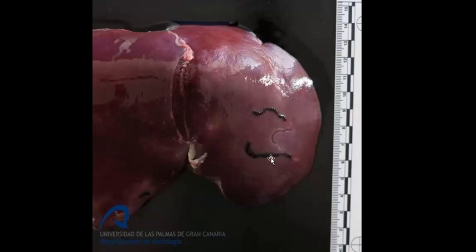And they're sort of these serpiginous tracts. They're usually elevated, somewhat hemorrhagic. They show up really nicely if the animal has a little bit of a fatty liver too, but this one showed up very nicely. Okay, so this is Cysticercus tenuicollis. This is the migration tract of the immature cestode.